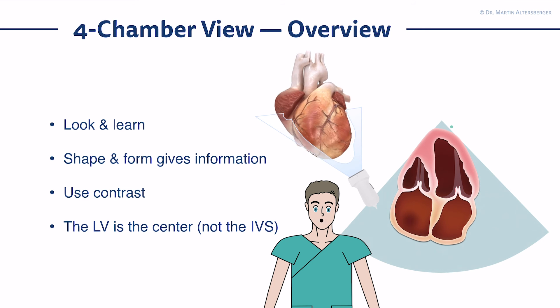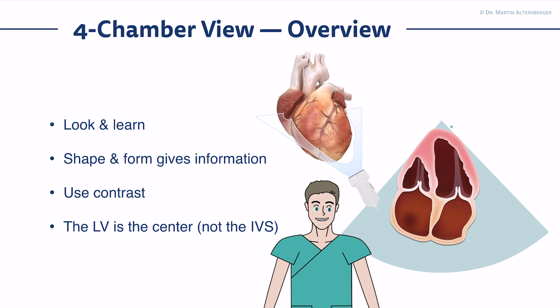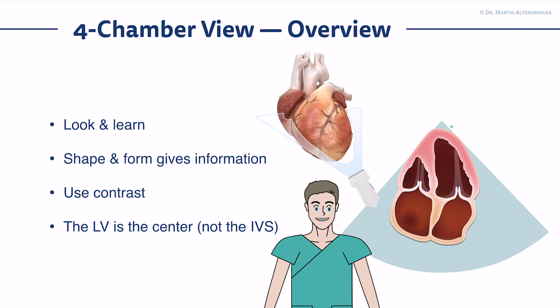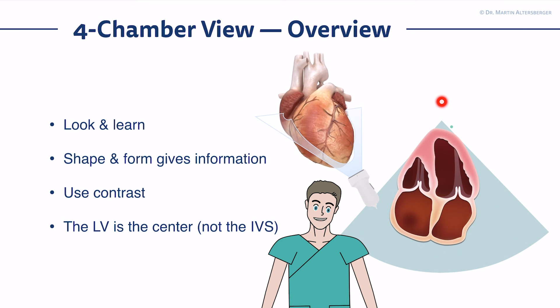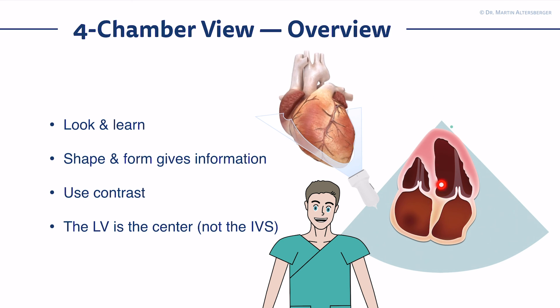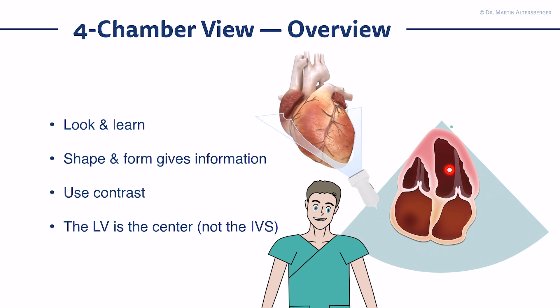Very important for future views: keep the left ventricle in the center. If you want to go to a two-chamber view and an apical long axis view, keep the left ventricle in the center — not, as is sometimes written, the interventricular septum. Because if you rotate around the septum, you will always lose the chamber. But if you have the chamber in the center and rotate counterclockwise 60 to 90 degrees, you will always get the left ventricle and left atrium in your field of view.